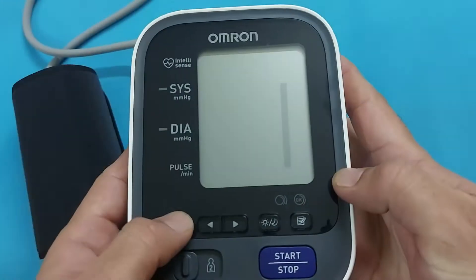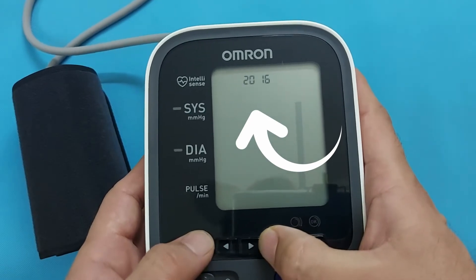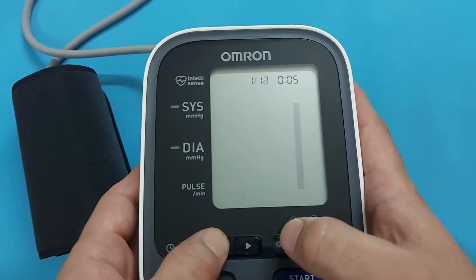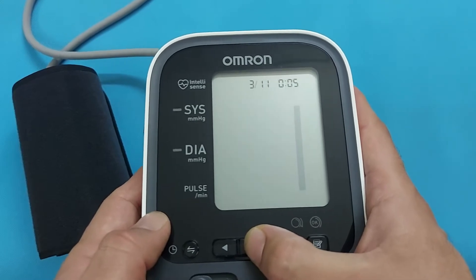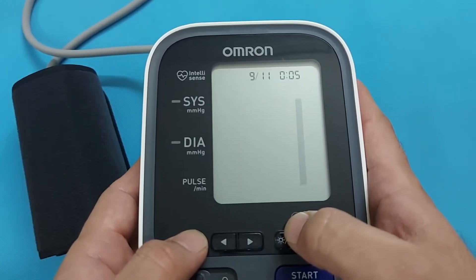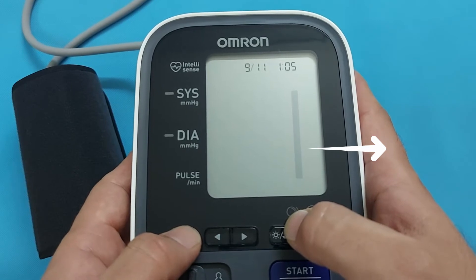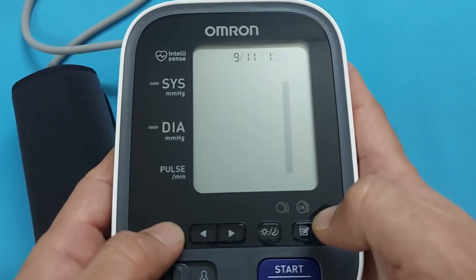Now we will make the setting for date and time. Press this button and the date will appear with the year. You can select the year format, the month format, and the date format. From this button, you can change the date, year, time, and time format. Make these essential settings by pressing these buttons and select your local time. When you connect this device to the smartphone, your date and local time will be automatically corrected. Make sure to set the time and date before measuring blood pressure.